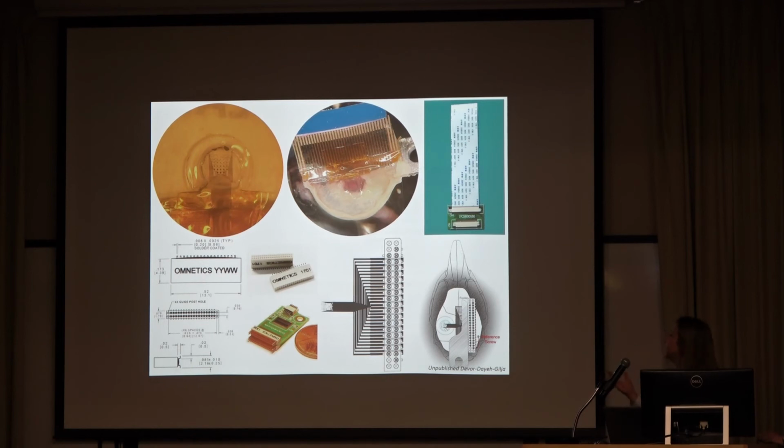For the other experiments, we were always using this ribbon cable, because the attachment to the array is easier on the production side. But with the ZIF connector, we tried to connect it directly to the head, but it required more force than we expected. The parylene is only 10 micrometers thick, so it broke in the end. We decided to change the connector.